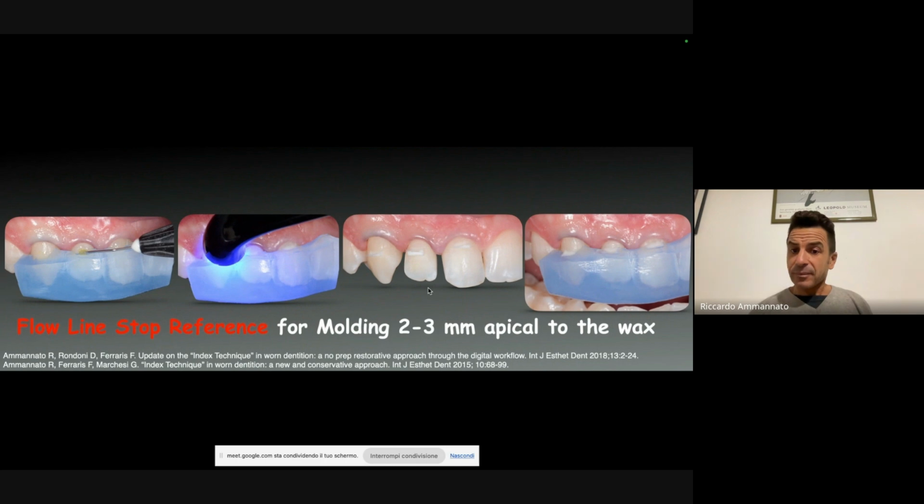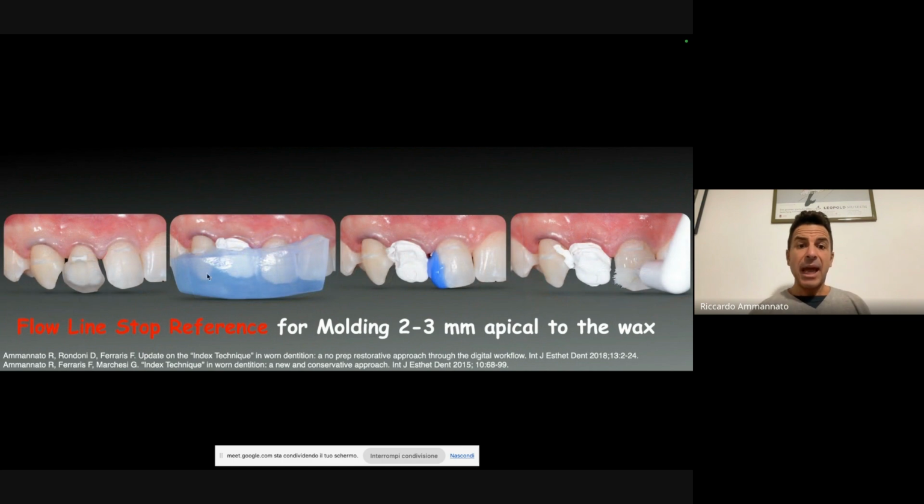Okay, so you see here I have my flow lines. So I will stabilize if and when I'm using my single indexes. And you see here I'm doing the try-in of this 3D printed key, and I'm checking that the index is kissing my stabilizer. Here I'm also playing with different options, just to share with you guys. So this distal part of the number 11, I will do it with this index, okay? And here I'm doing the adhesion protocol.